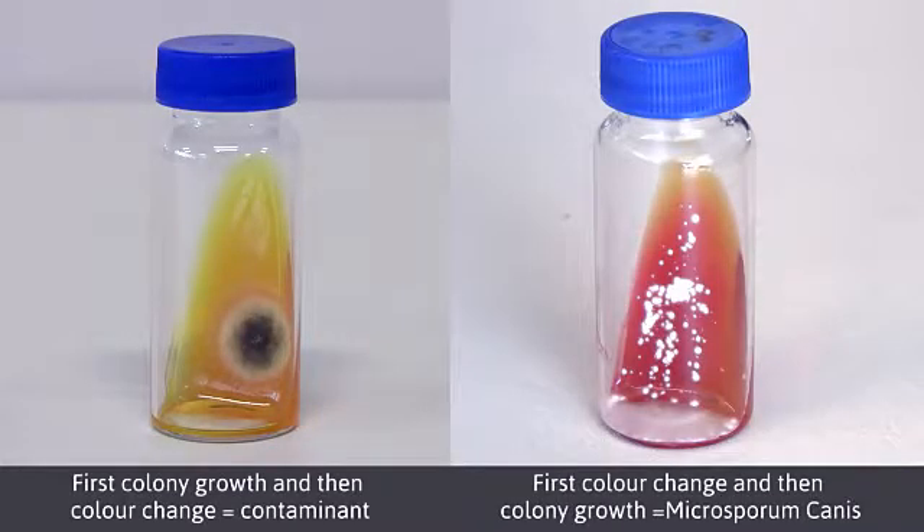Any change in color from yellow to red before colony growth is interpreted as positive for the presence of dermatophytes. Conversely, if colony growth occurs first and then the medium's color changes, the sample is interpreted as negative for the presence of dermatophytes.